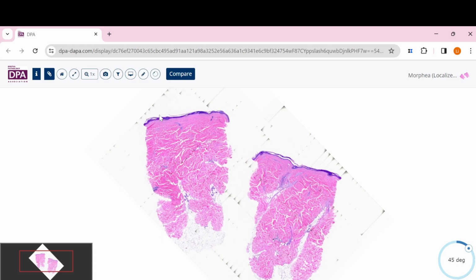If you see a square punch, that means something is going on in the dermis, either like this diagnosis Morphea. That means the sclerotic collagen just makes this square punch. Another square punch, that means a lot of cell infiltrates in the dermis, maybe just like dermatofibroma, or maybe metastatic breast carcinoma. A lot of cells just infiltrate in the dermis, so you may make another square punch. But to focus on this slide, Morphea, that means everything is just sclerotic.